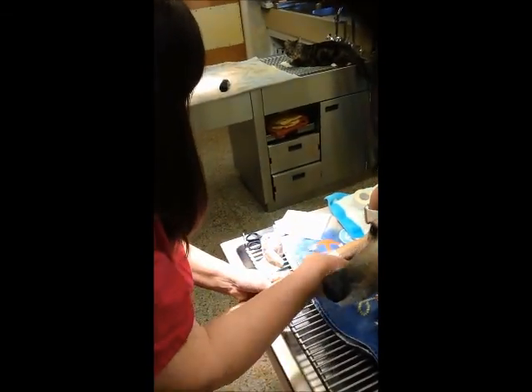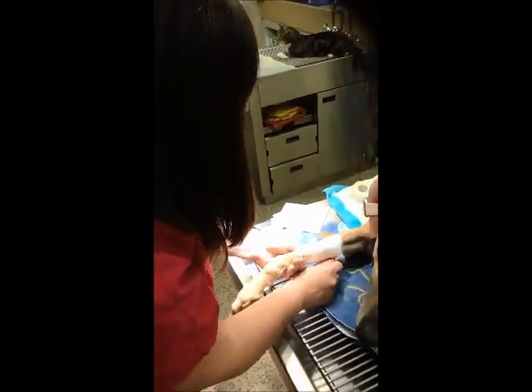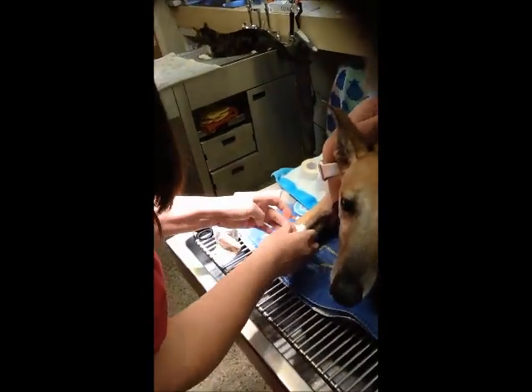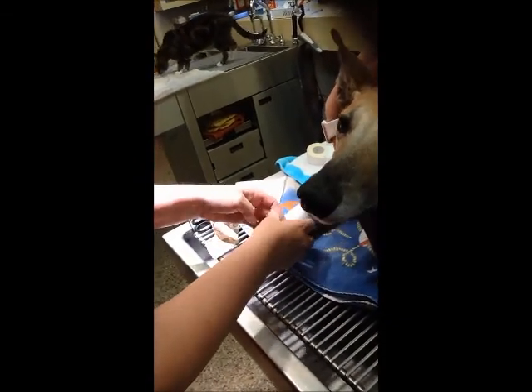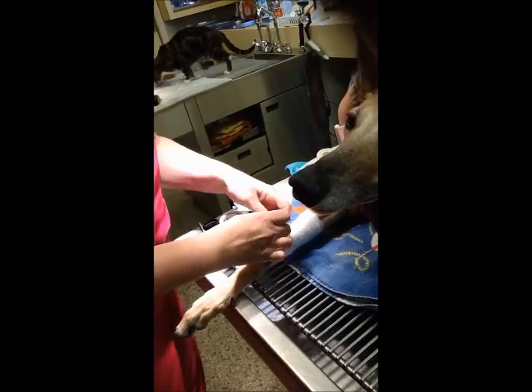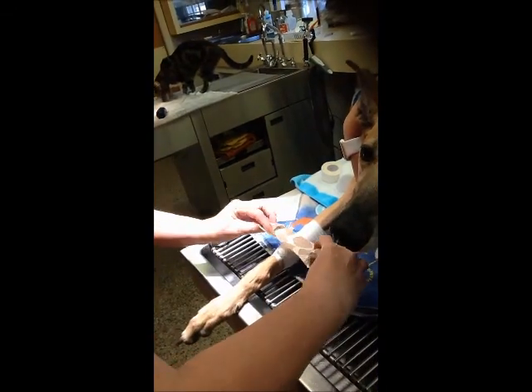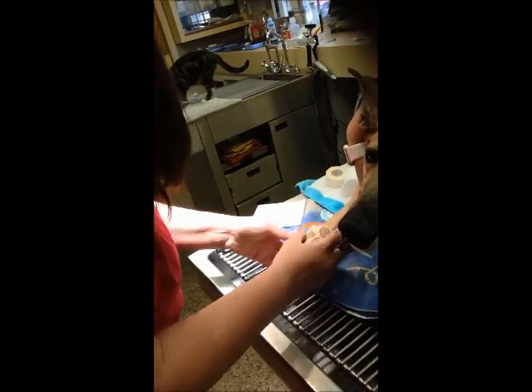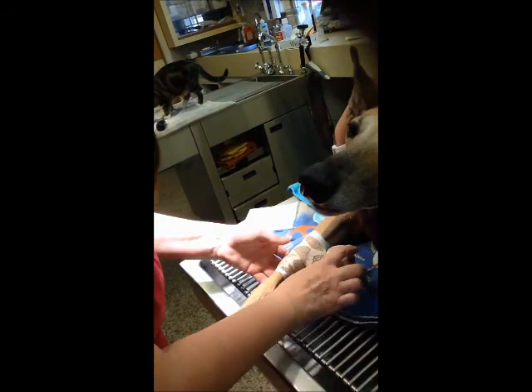You're just going to pull it a little bit taut. And then your vet wrap. You're just going to lay it flat and not pull too tight.